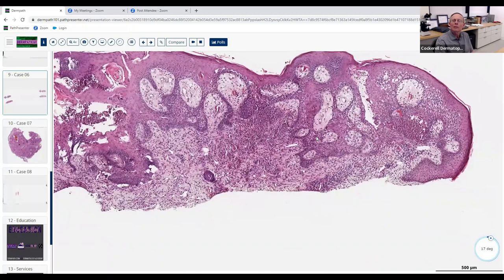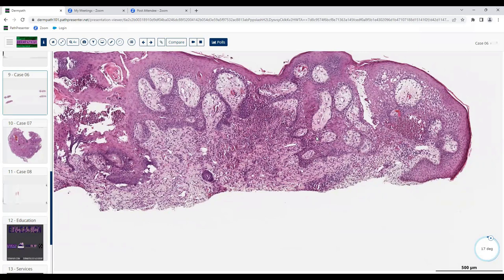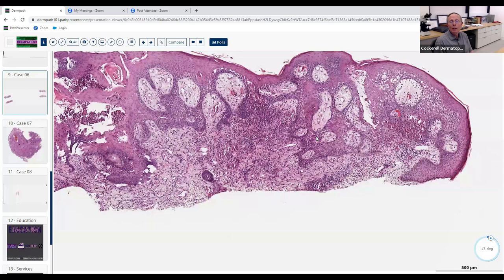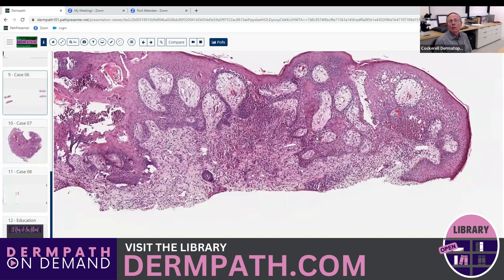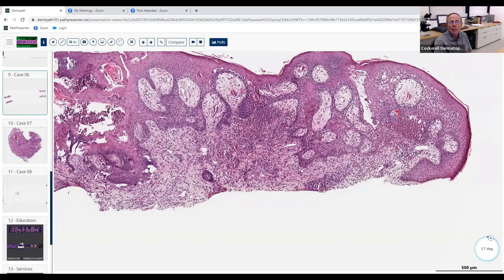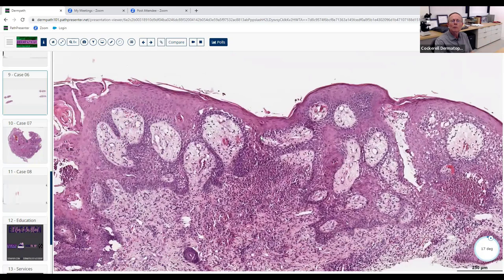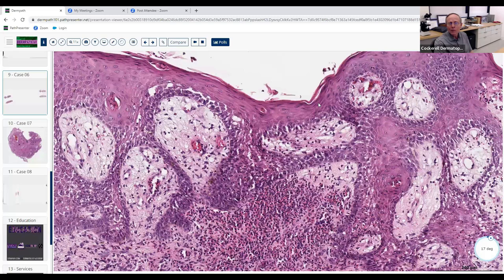What else is in the differential besides incontinentia pigmenti and pemphigus vegetans? You could think of arthropod reaction, acute contact dermatitis, pemphigoid, herpes gestationis, and drug reaction — those are excellent. To distinguish among them, this markedly thickened epidermis with a 90-degree sectioned cornified layer confirms it's not tangentially sectioned. All of this is pseudocarcinomatous hyperplasia — that helps favor pemphigus vegetans.